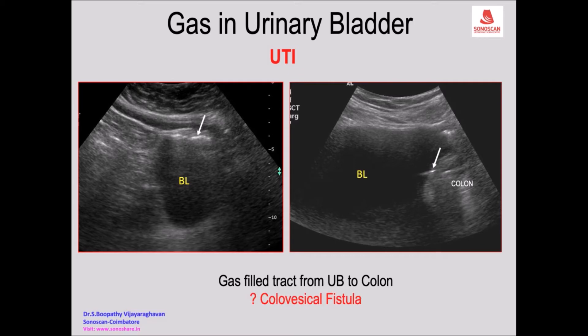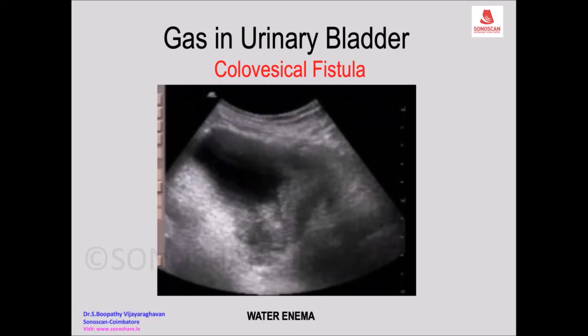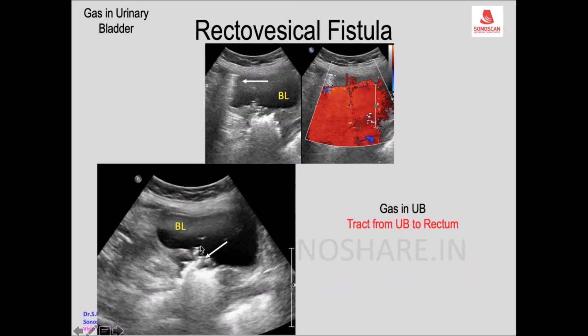You suspect colovesical fistula but you are not seeing the tract confirming it. Now we have diagnosed gas in the urinary bladder with a colon that is not thick-walled, but you see uninflamed diverticula here and there. This is an inflamed diverticulum in the proximal colon with a colovesical tract.